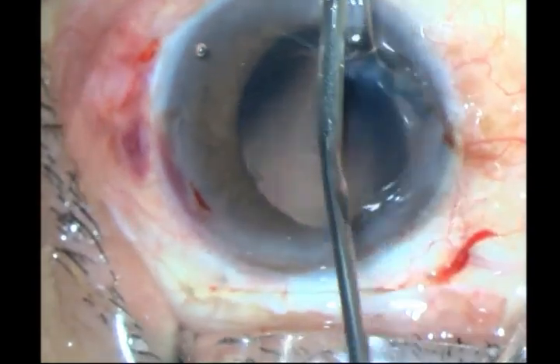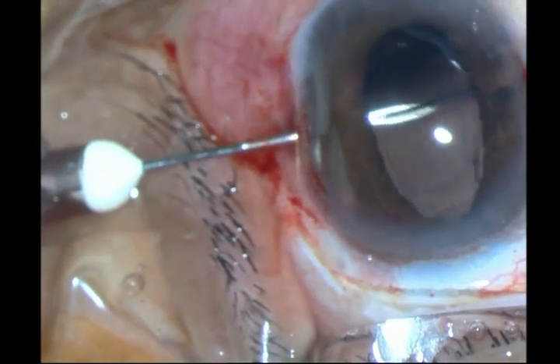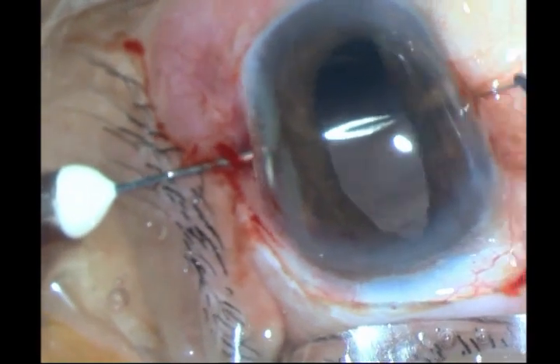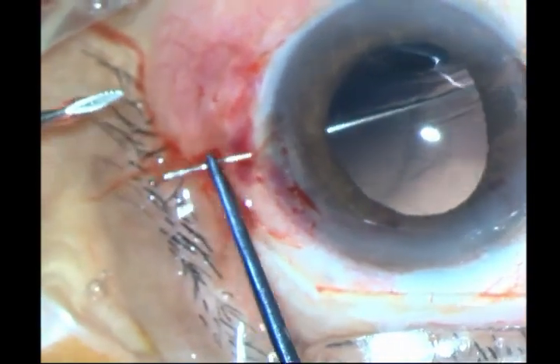I should have closed the incision and done this — this is a vitrectomy eye, it is going to be soft. There is a large incision there although it is self-sealing. Anyway, I have railroaded one scleral suture through my Hoffman tunnel. I go about one millimeter onto the limbus on either side.